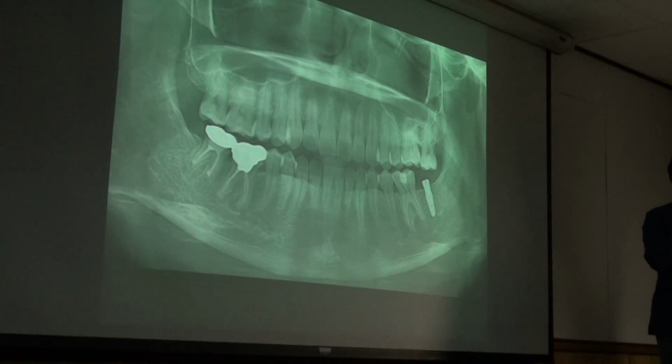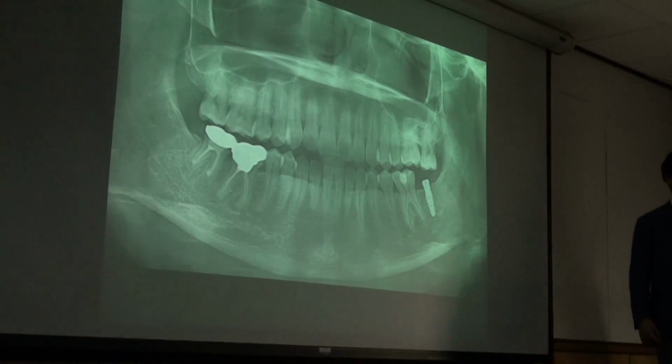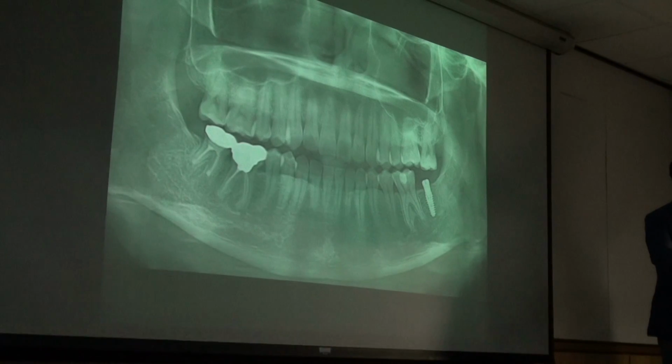ISQ? Yeah, right. So ISQ is a very useful method for the time factor. Our suggestion is that when you place the implant, you have to check two factors, ITV and ISQ.